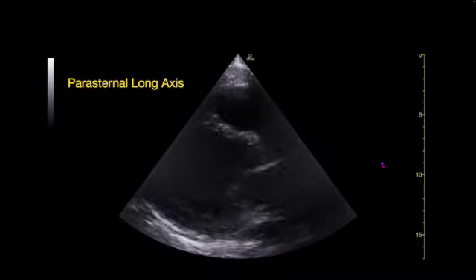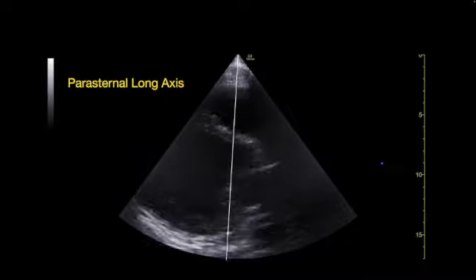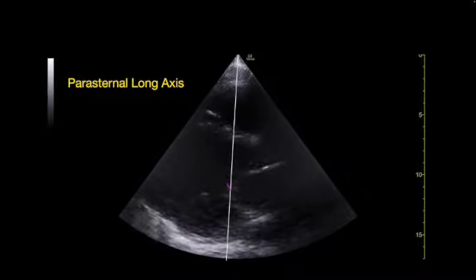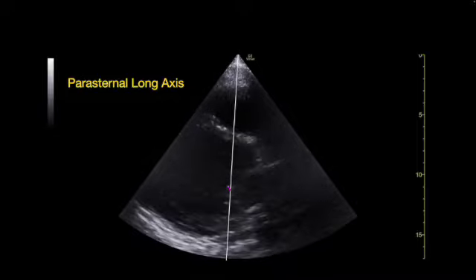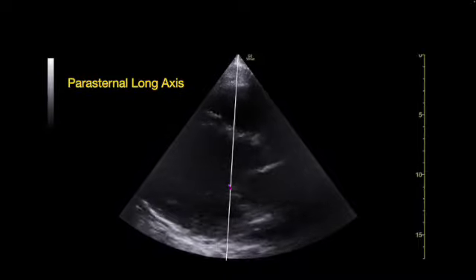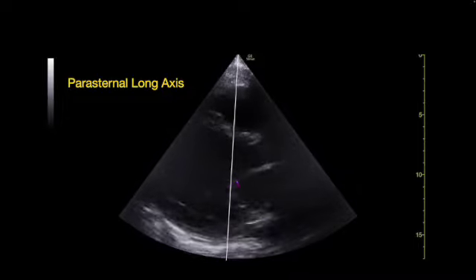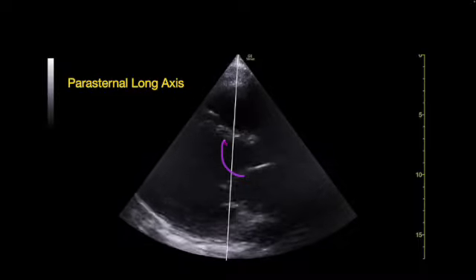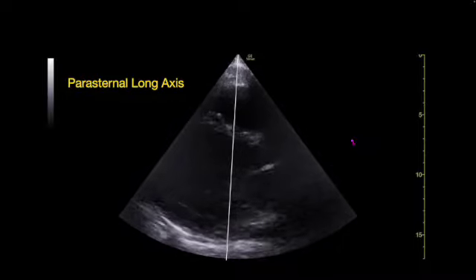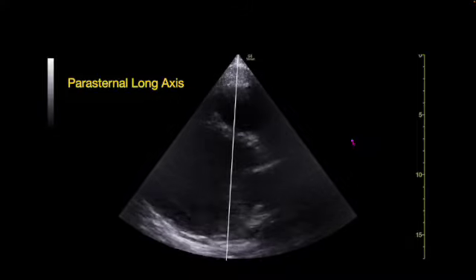And you learned something called EPSS, right? You grab your M mode spike, you put it through the anterior leaflet of your mitral valve because you want to see E point septal separation. How far is our mitral valve separating from the septum? Remember, during diastole, that mitral valve should be swinging open and hitting the septum. What's happening in this patient? It definitely is not. Now, when you get more experience, you could just eyeball it and say, oh, that's definitely reduced. That's about 20%, 25%.